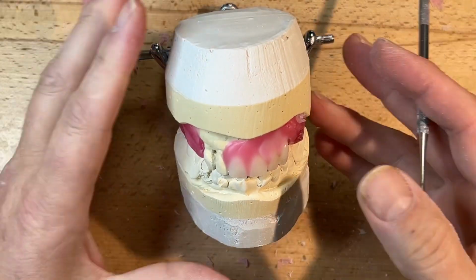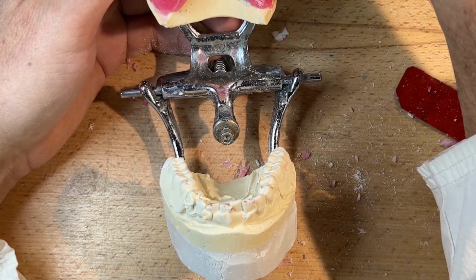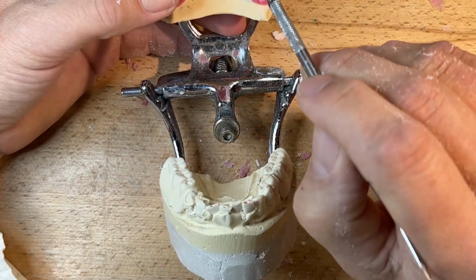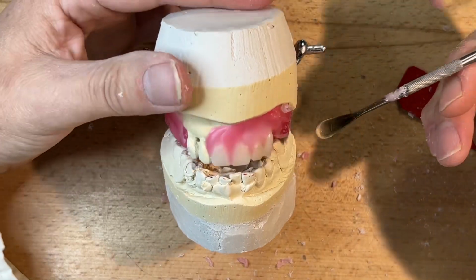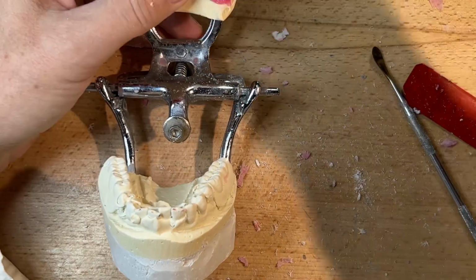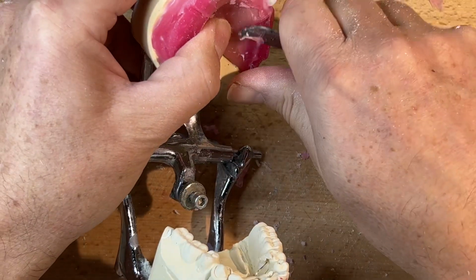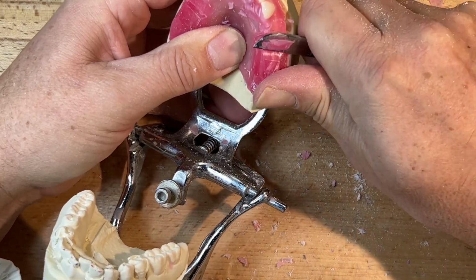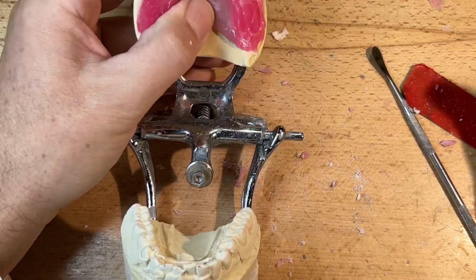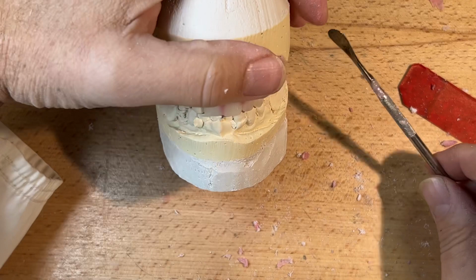Now, at this point here, I've got the anterior 6 waxed on, or 4 with the 2 natural teeth. I can choose to continue on this side, or I could go back to this side. I'll probably just keep continuing along the right-hand side, only because as a right-handed dental technician, I have a habit of always doing the patient's left side or second quadrant first, being also a right eye dominant dental technician.